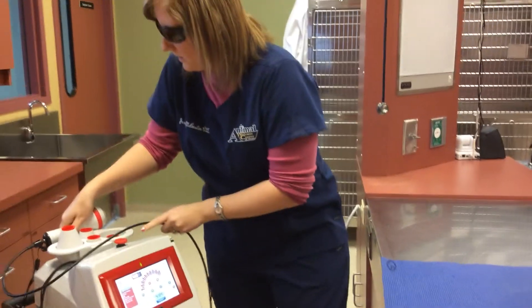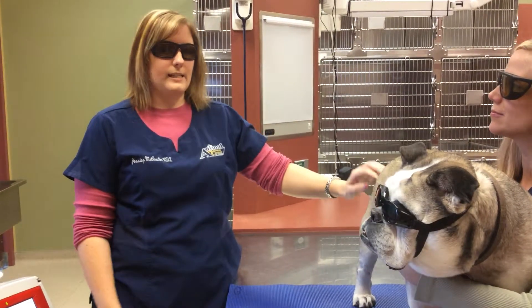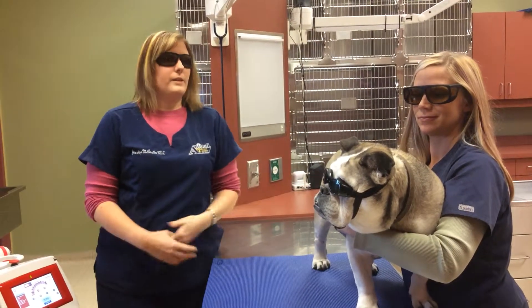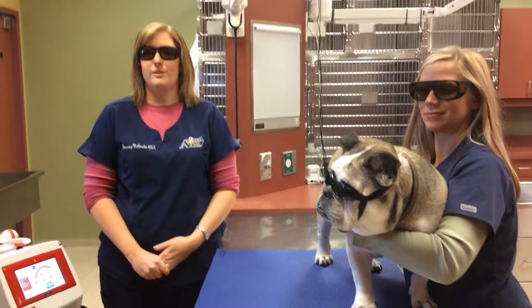So we're going to move down. And since arthritis is a chronic pain, we're going to do at least six treatments on her. After the six treatments, we'll assess and see how well she's done. And hopefully this helps demonstrate how the laser can be used all naturally to treat your disorders.